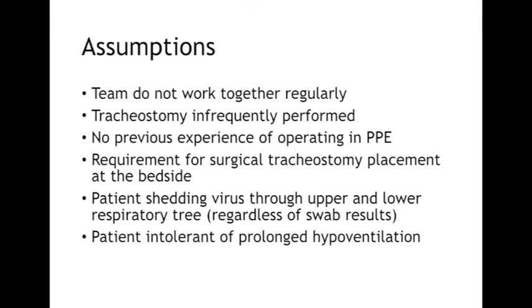The resource implications for taking infected patients to theatre may not always be possible, and consequently a bedside procedure has been developed. We are aware that there is controversy with regards to swabs from the upper and lower respiratory tracts, and essentially the patients must be assumed to be shedding active virus at the time of the procedure. We're also aware that these patients may poorly tolerate prolonged periods of hypoventilation, and the protocol has been set up to try and minimise this.